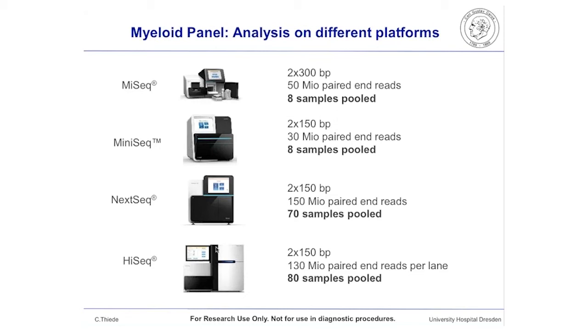When you compare all these 4 platforms, we have to say that especially the MiSeq is very well suited. In our experience, the MiniSeq also works very well, and the NextSeq, but the HiSeq results were somewhat suboptimal, and I will come back to that during my talk.